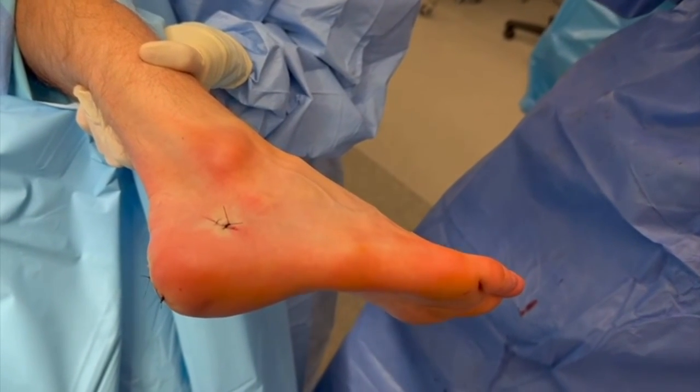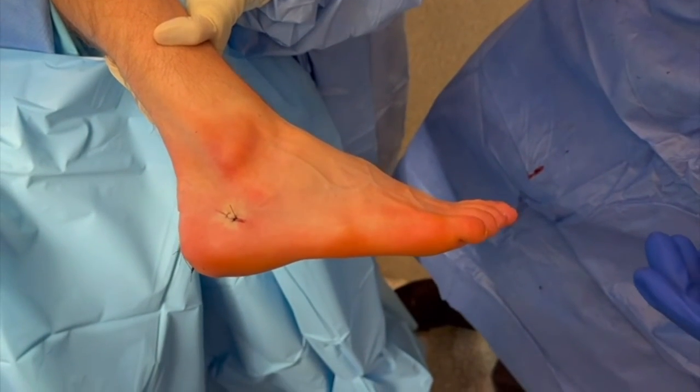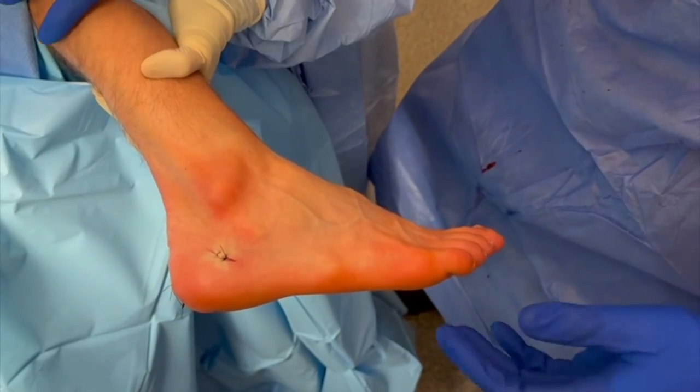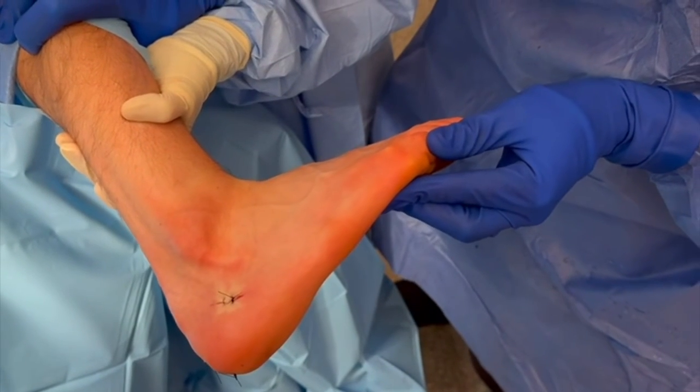I'll now show you the increase in ankle dorsiflexion with the knee straight. My assistant is currently holding the knee straight. This patient had a mild 5 to 10 degree gastrocnemius contracture pre-op, and now we're going to dorsiflex the ankle — you can see he easily comes up past neutral.